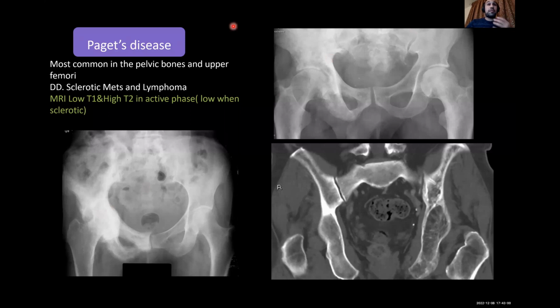And don't call it by eye experience, because that was from when we were using films in the X-ray. But now everything is digitalized. You can be deceived easily, can be easily deceived by some playing with the factors in the workstation.